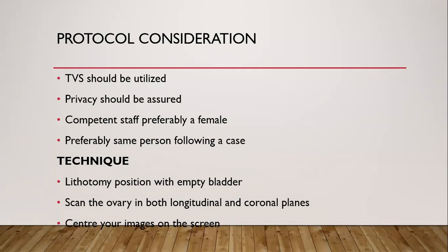The reason is simple. If I do the scan and I notice, let's say in the baseline ultrasound, that there's a follicle which I assumed could have been a dominant follicle, then when I get to scan after 7 days, I will be able to reassess that follicle that I saw and do the measurement to say if what I saw earlier was the dominant follicle or not. And I'll be able to make a comparison of the changes that take place between the scans.